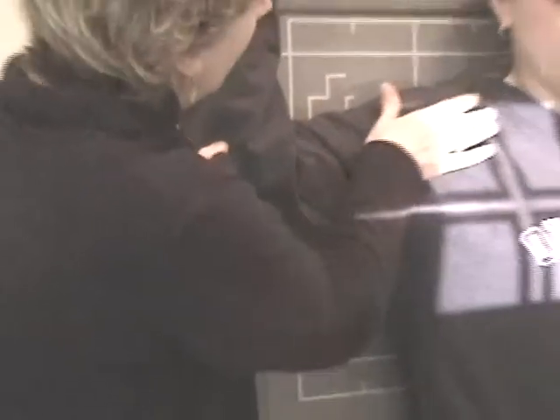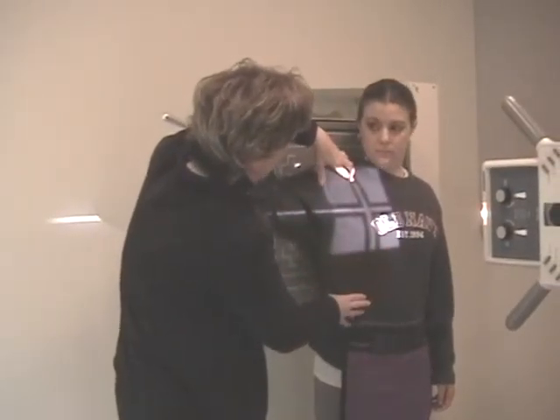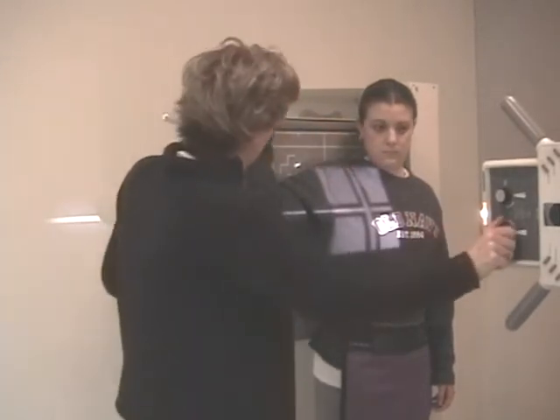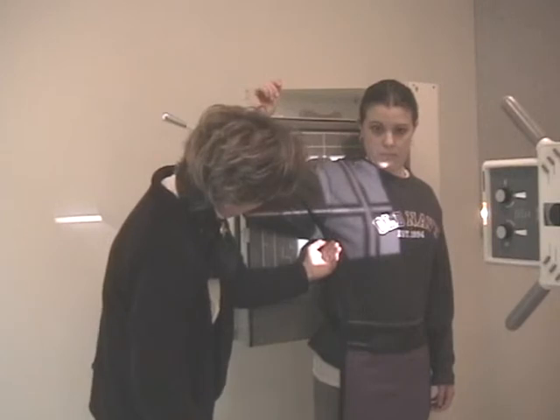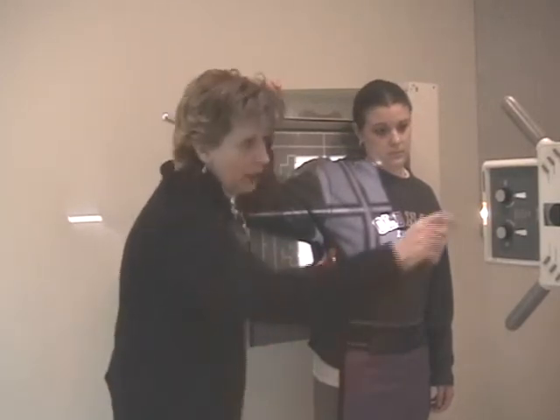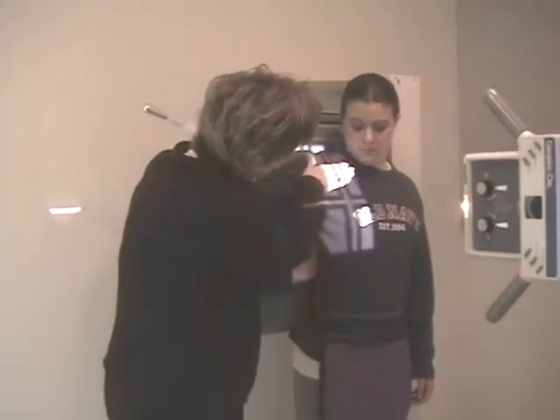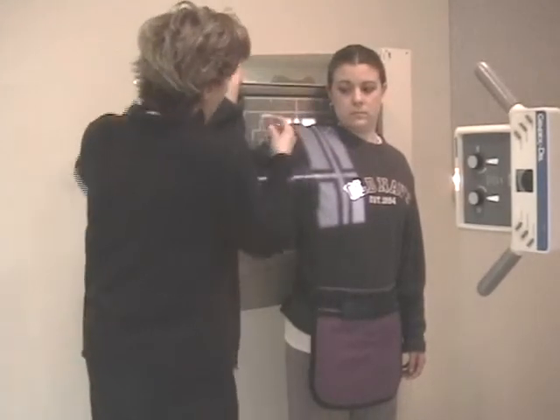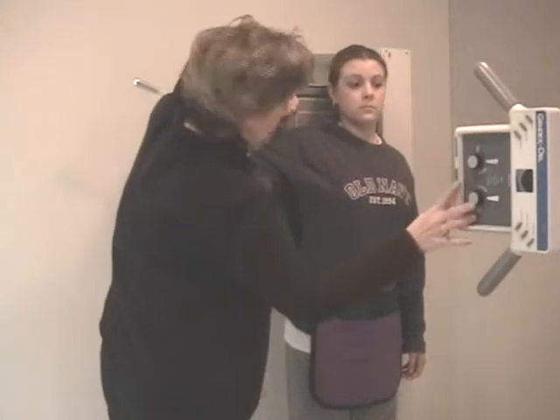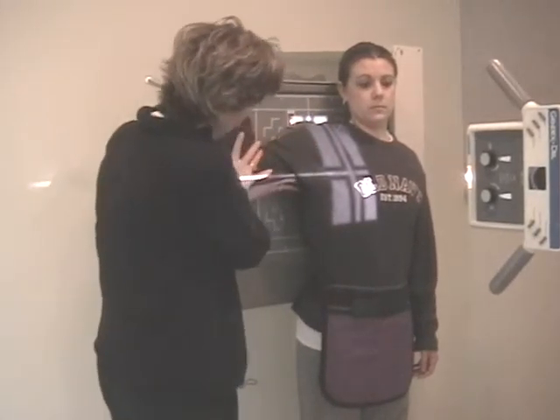The arm is at 90 degrees and I'm going to find the coracoid process — the V. Collimation is 10 by 12, but depending on the size of the patient, I have too much collimation on the side. I want to tighten that field up — going to 12 inches in length and coming in side to side, just where it's skimming the body. Make sure that the medial border will be on there, then put a right marker on. Get the lead out of the shadow. Arm at 90 degrees, patient holds their breath, and you make your exposure.